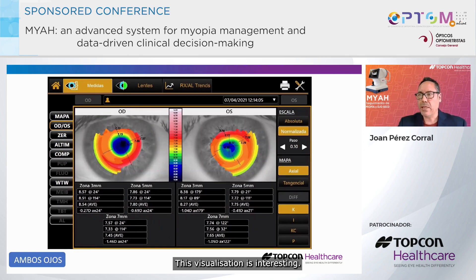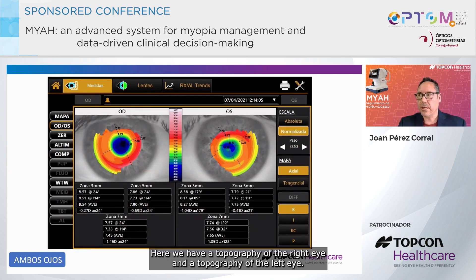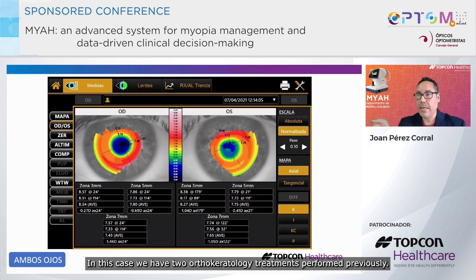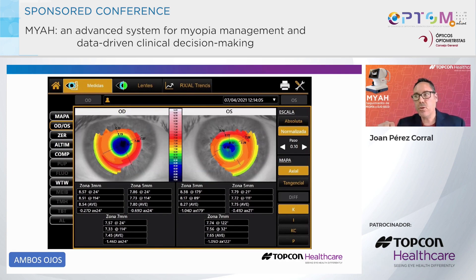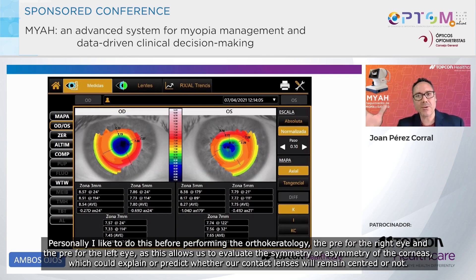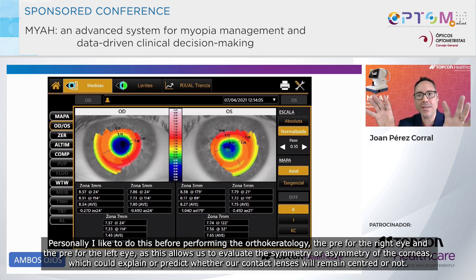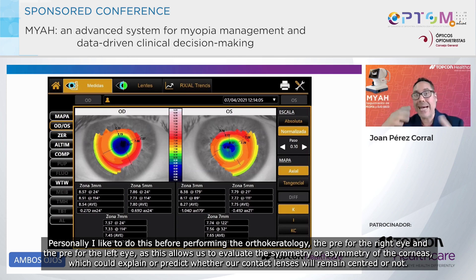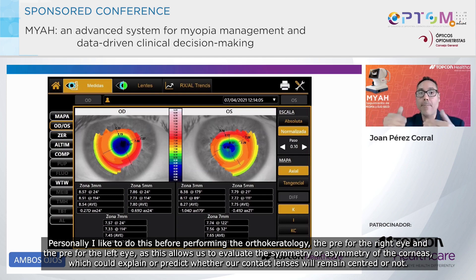This visualization is interesting. Here we have a topography of the right eye and a topography of the left eye. In this case, we have two orthokeratology treatments performed previously. Personally, I like to do this before performing the orthokeratology — the pre for the right eye and the pre for the left eye — as this allows us to evaluate the symmetry or asymmetry of the corneas, which could explain or predict whether our contact lenses will remain centred or not.